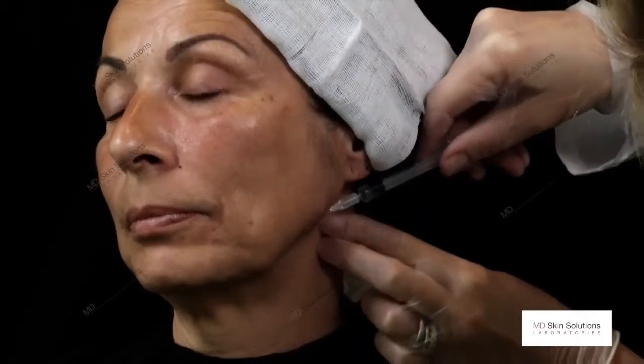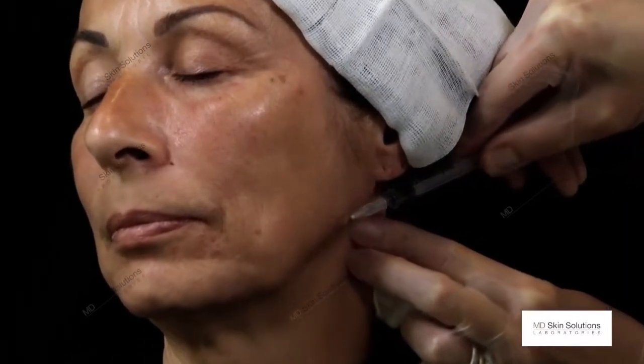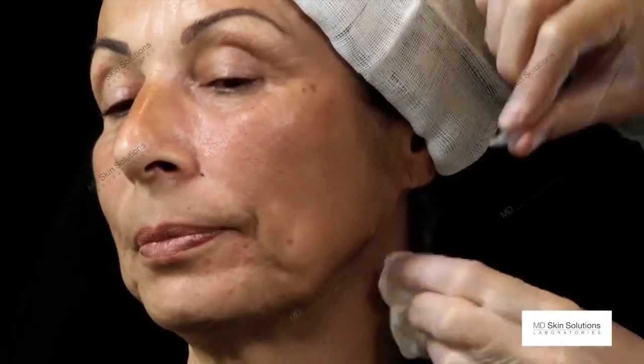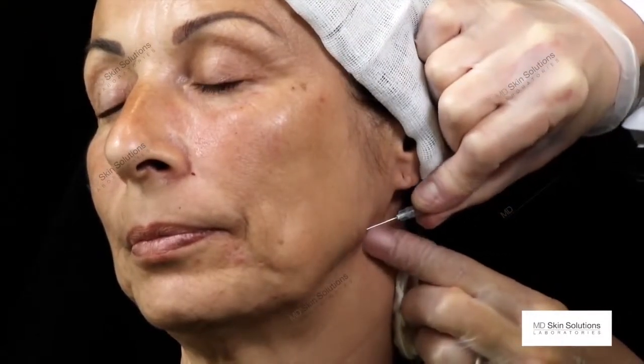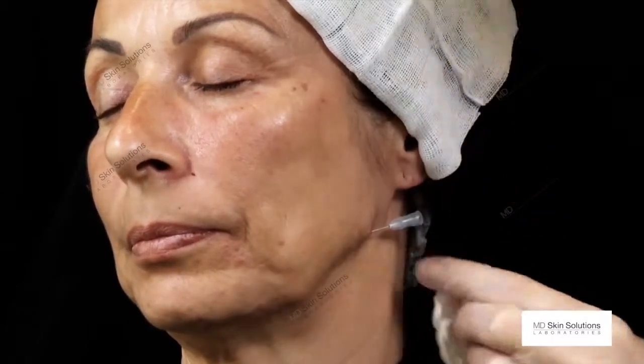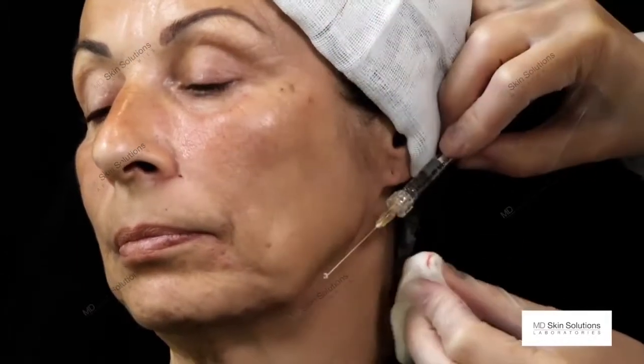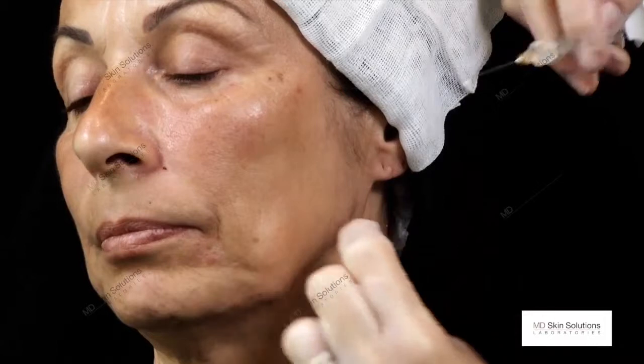By a cannula treatment, putting a little bleb in for the entry point for the cannula, using a 23 gauge needle to do the entry point, again tunnel the way, and then I will use again the 25 gauge 1.5 inch blunt cannula. In her case, the 1.5 inch is totally enough in terms of length.